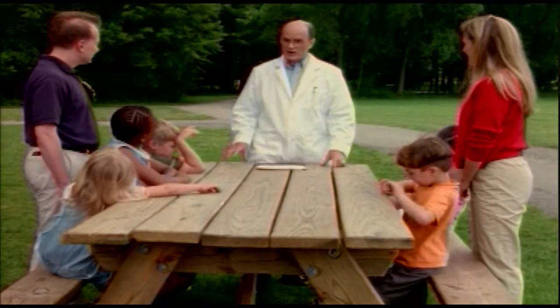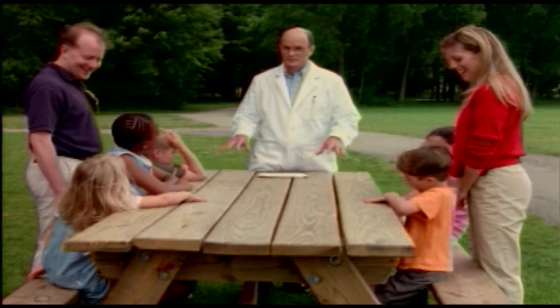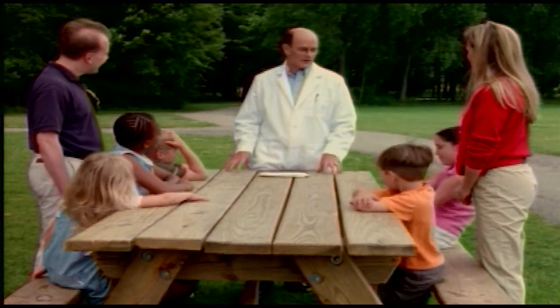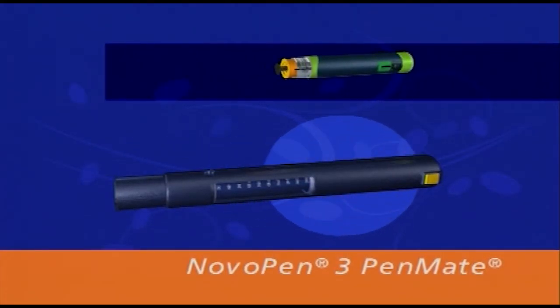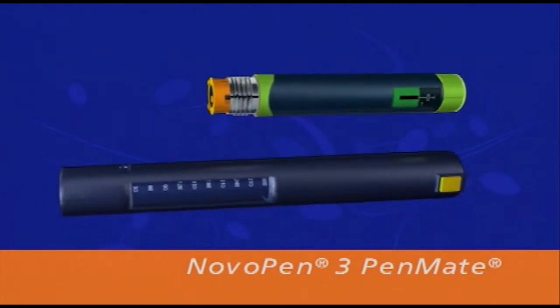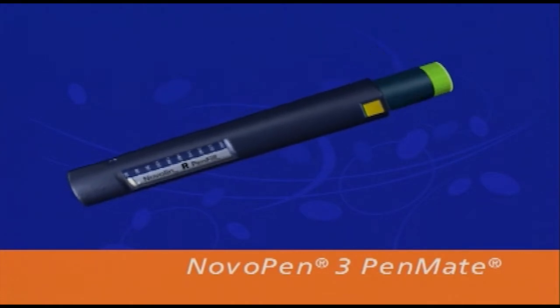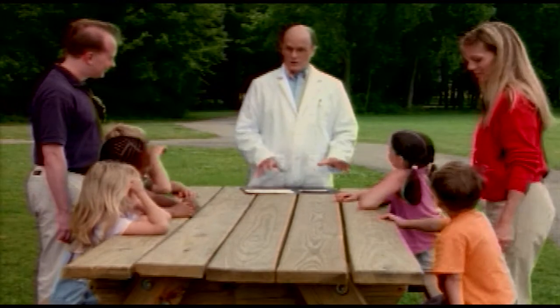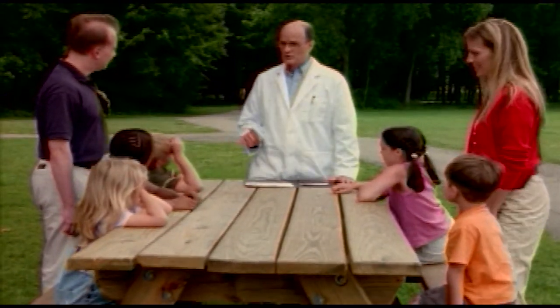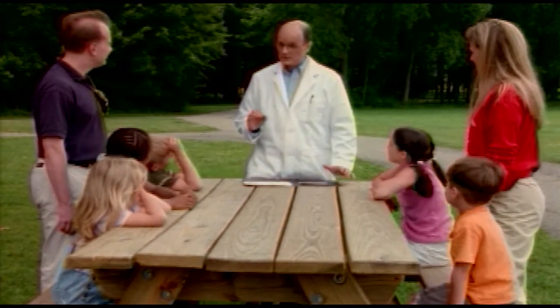Are you ready to learn about the final part of your NovoPen Jr. diabetes management system? The Novopen 3 pen-mate tends to be very popular with my patients. It helps insert the needle for quick and easy injections. Now that you know a little bit about your NovoPen Jr. diabetes management system, I'm going to show you how each part works together to help with your insulin injections.